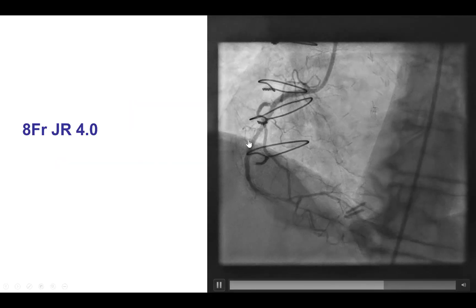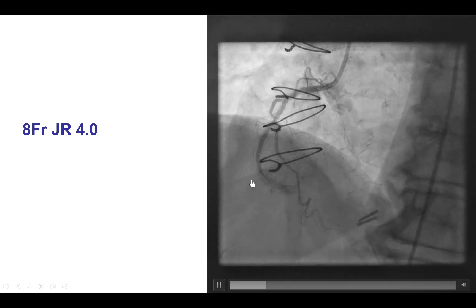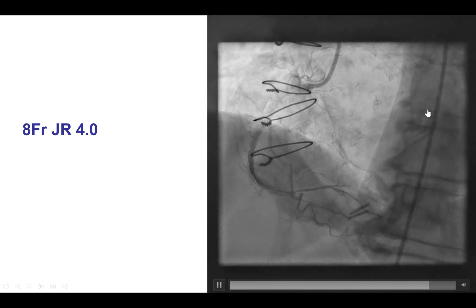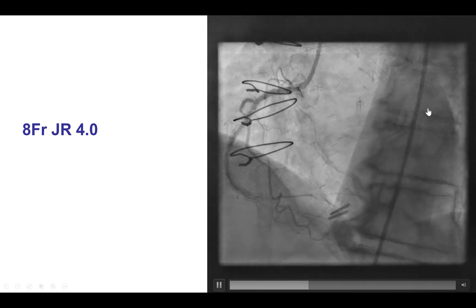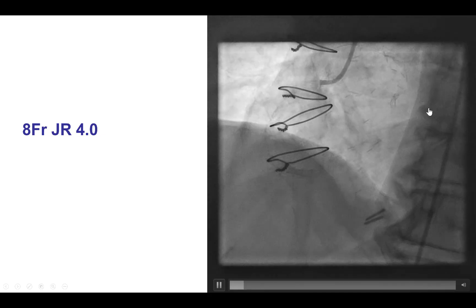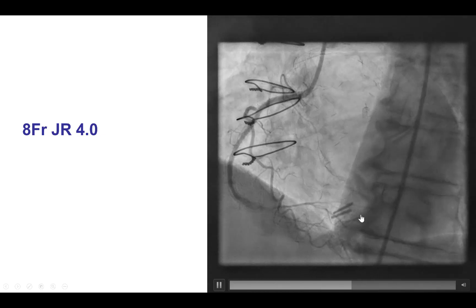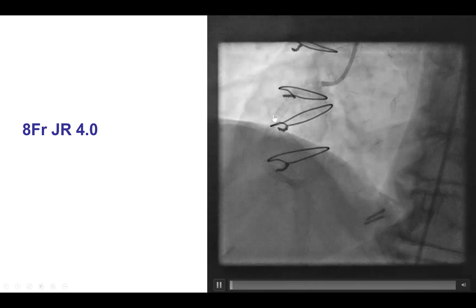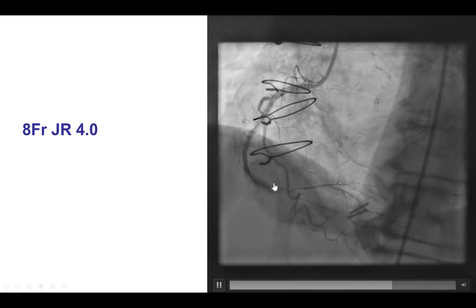This is the initial diagnostic angiogram of the right coronary artery. Often in patients like this who are referred for brachytherapy, there is significant underlying disease requiring extensive treatment, and that is why we used femoral access with a large guide, which came in handy as we will see subsequently.